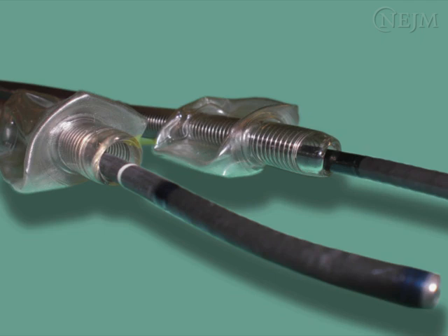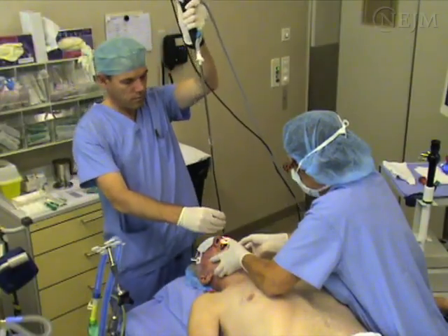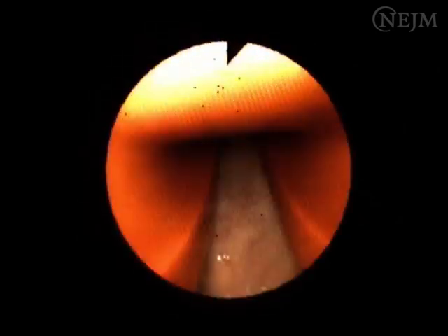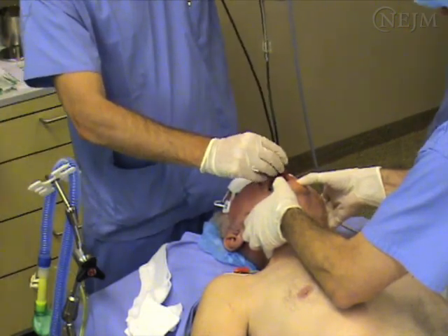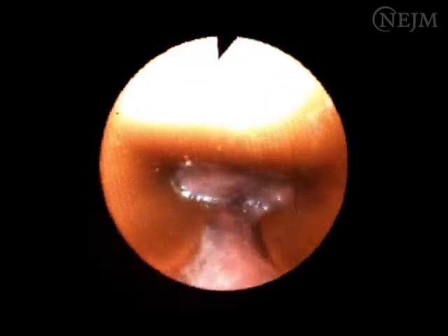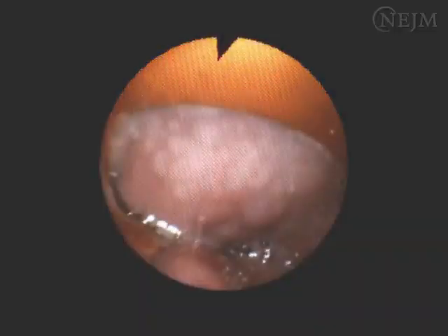It is very important to minimize the gap between the tube and the fibroscope, since a small gap decreases the likelihood of difficulty when advancing the tube over the fibroscope, especially in the posterior arytenoid region. When performing oral fiber optic intubation, be sure that the chin lift and jaw thrust maneuver is adequate and be certain that the slit oral airway is the right size. In general, for adults a number 4 slit airway is the appropriate size. If the oral airway is too large, it will obstruct your view through the fibroscope as you advance towards the glottis.